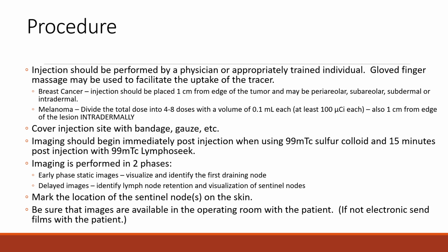And then you'll cover the injection site with a bandage or gauze. For the breast, you want to have the patient with gloved hands massage that area. A lot of times they will put chucks over it, and then have them massage it gently with their hand. That helps encourage it to get from the tissue into the lymph. Also, putting a warm blanket on them, the heat actually really helps to move your lymphatic system. So do that. And you want to cover the injection site with bandage or gauze.